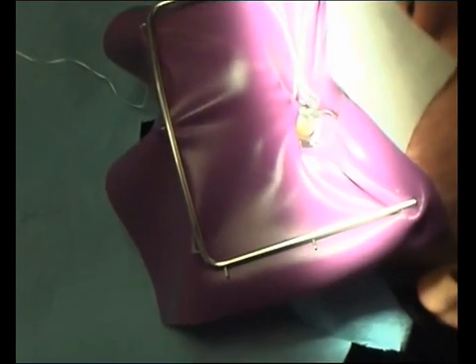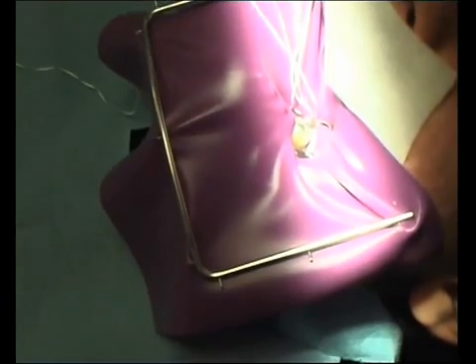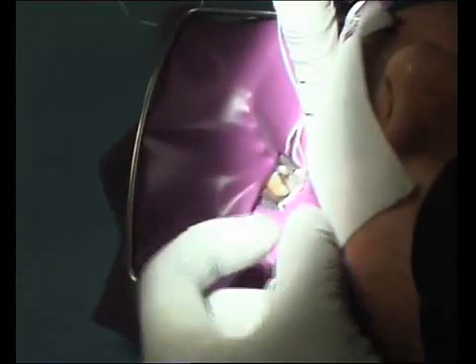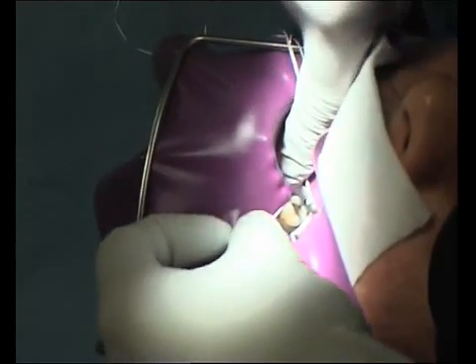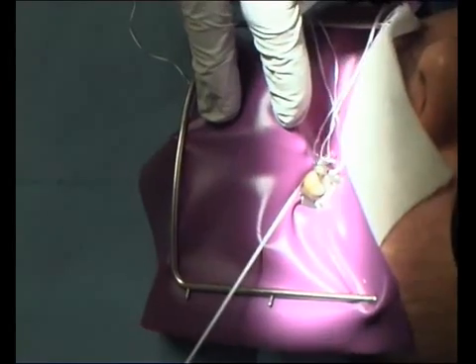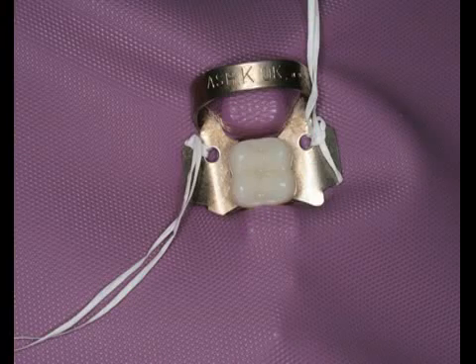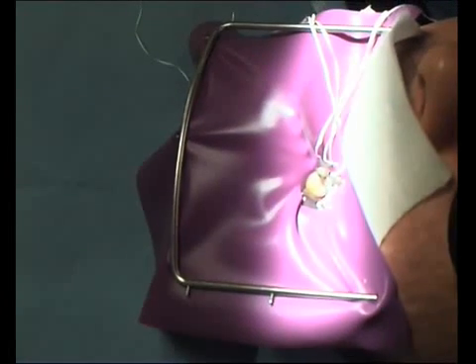And then the last thing is a bit of floss. I won't show Oraseal because you don't use that up at London — I better not show that, otherwise that might spark off a diplomatic row. I'm just going to force that now. Pull out through the side — and we're done. Rubber dam done.